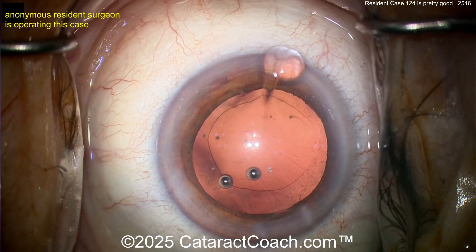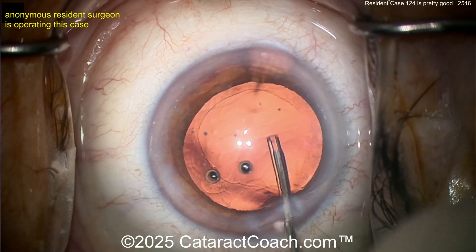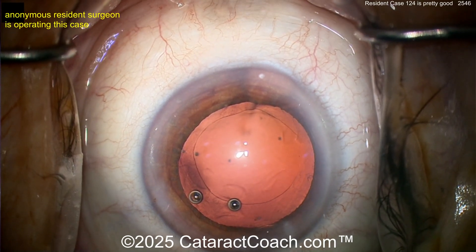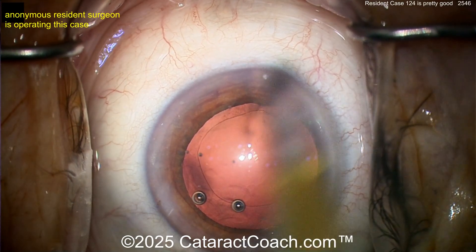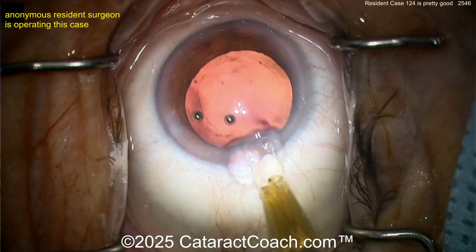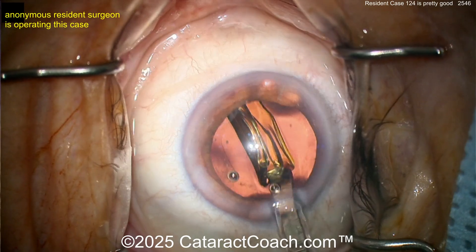That looks like a reasonable case so far. Let's get the viscoelastic in. I like the incision — at the beginning I wasn't so sure, but now you can see it's a little bit hydrated from the surgery. Now injecting viscoelastic — interesting with the soft tip on that cannula. For lens insertion, you're doing a great job for case 124. The rhexis needs work — it's reasonable but you can hold yourself to a higher standard. Looks like a two-handed injector; the eye is coming out of primary to deliver the lens, then back at primary — pretty good.